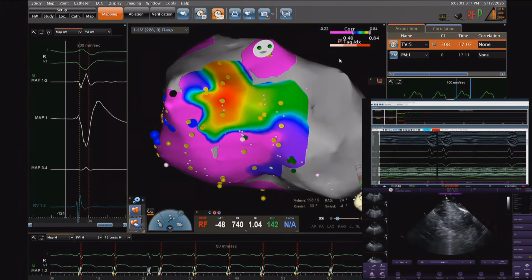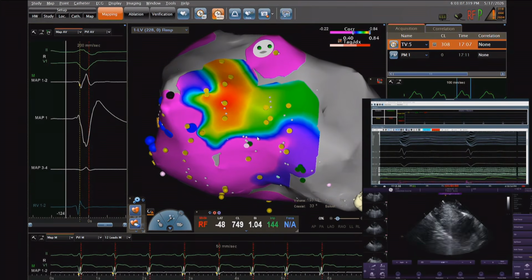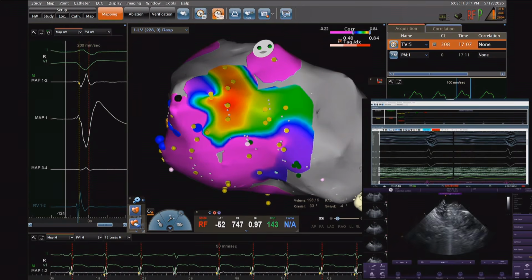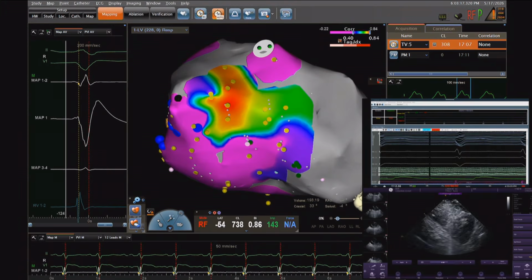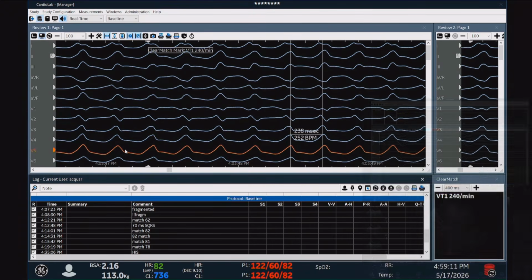Okay. So here is the RAO view. This is not RAO, or kind of modified RAO, with downward tilt, if you want to be precise.